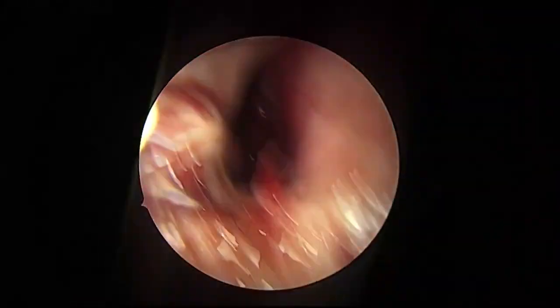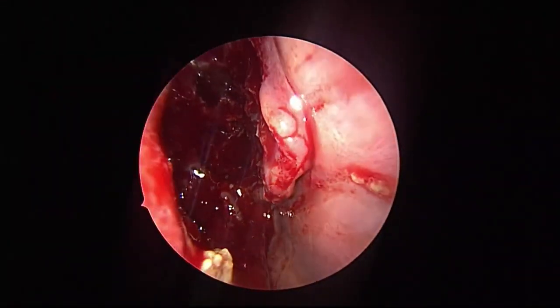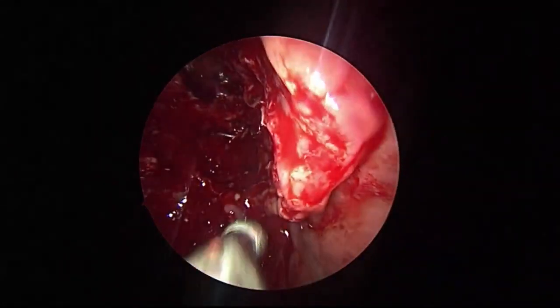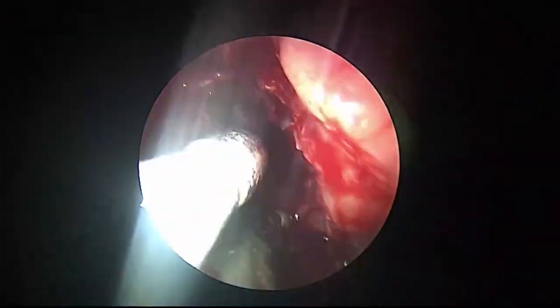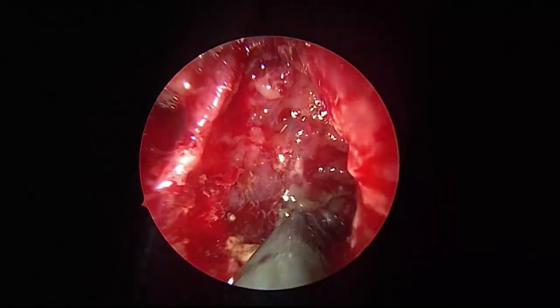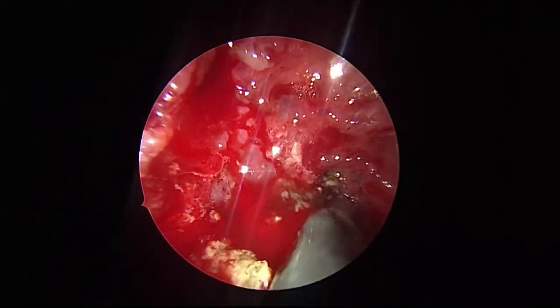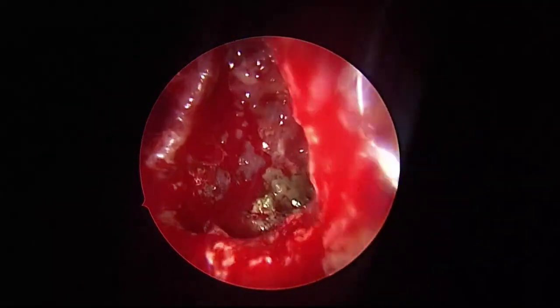Traction is an amazing tool. So another chunk.